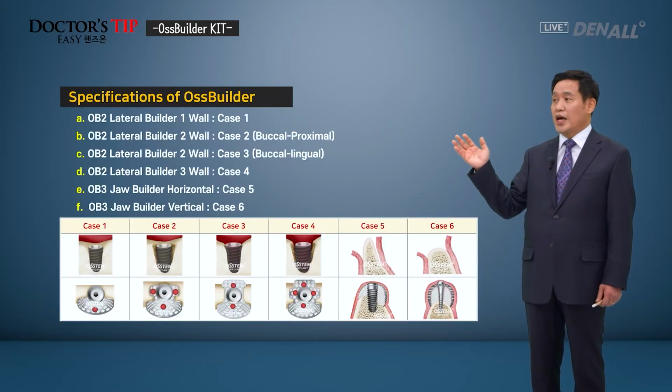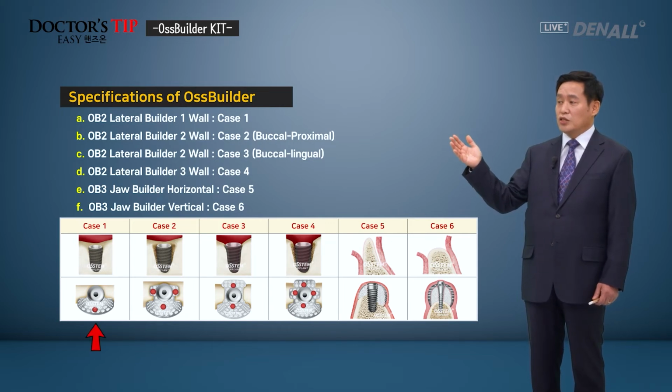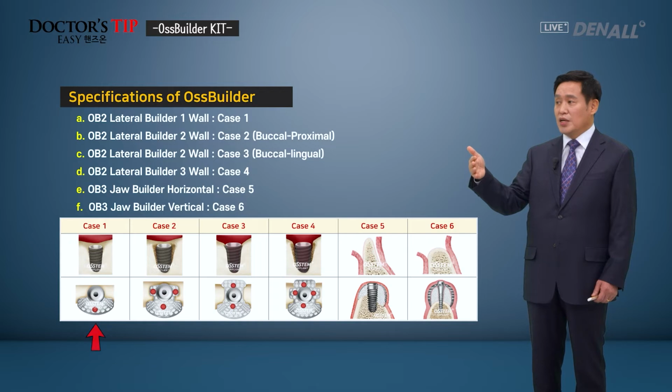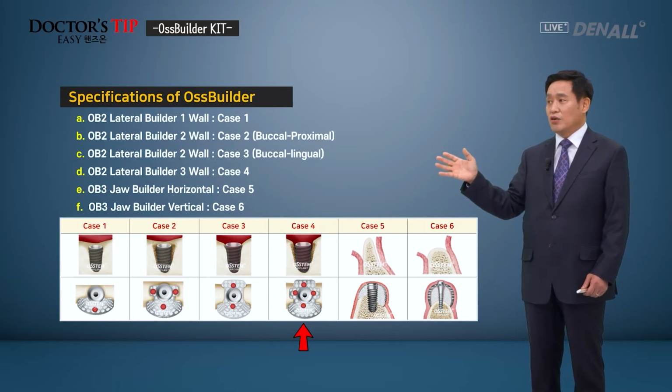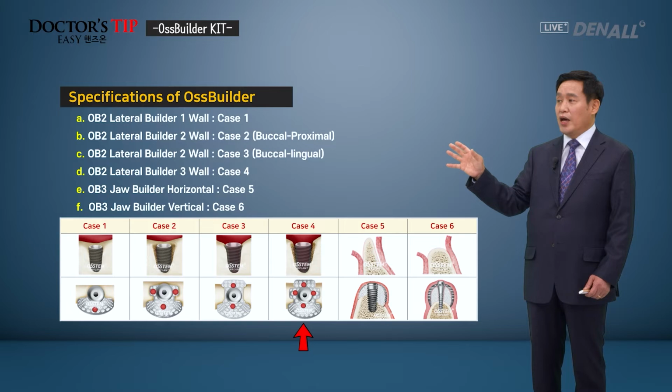Next is the specification of OssBuilder. Basically, I showed in case 1, on the buccal side, if there's dehiscence or fenestration, you can use it. In case 2, buccal and proximal defect. Case 3, buccal and lingual defect. Case 4, buccal, lingual, and proximal. In those cases, you'd be able to have some options and make your choices.